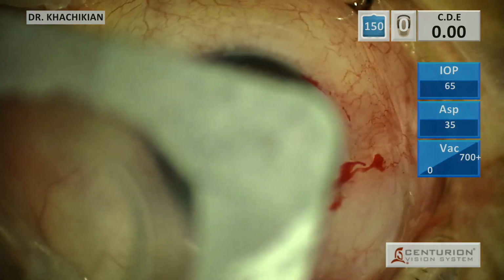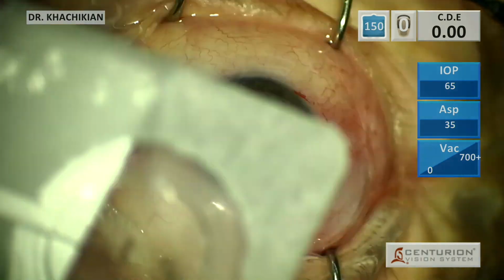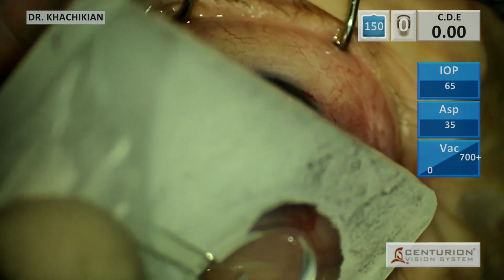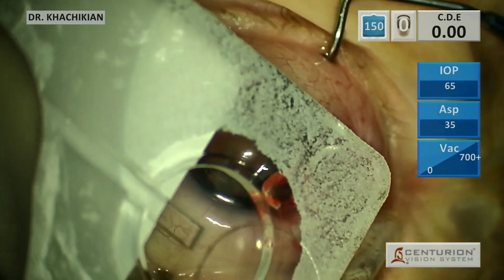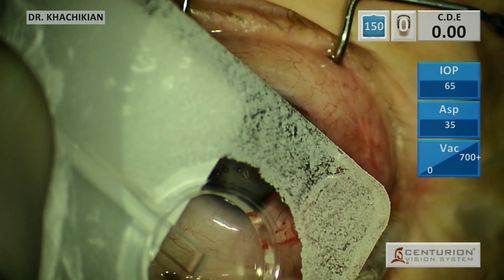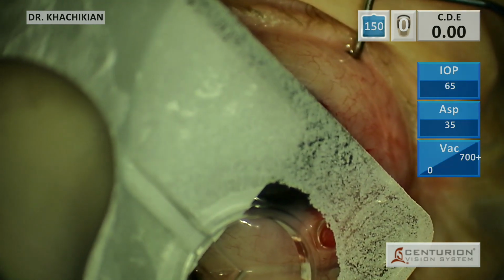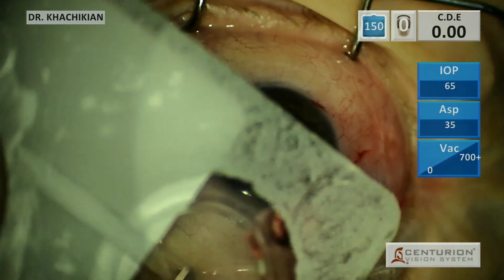So here we go with our capsular tension ring. For some reason, at the moment, we can't get the preloaded ones. We have to get the unloaded, and a lot of times I will put these in manually. You can just spin it around the capsular bag from the main incision in routine cataract surgery, but that only really works well if you only need one hand. You really have to have two hands to do that, and both of them have to be pushing the capsular tension ring in, which is fine when the capsular bag is open 360 degrees and is not going to get hung up in any areas.